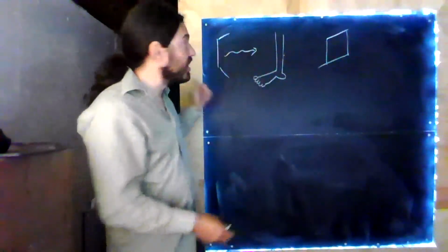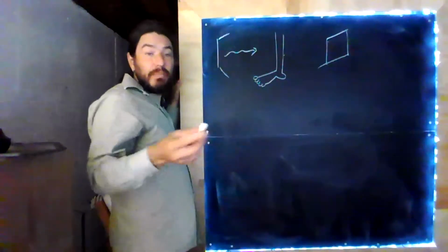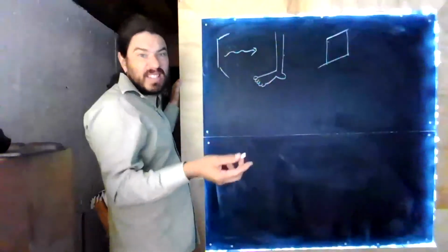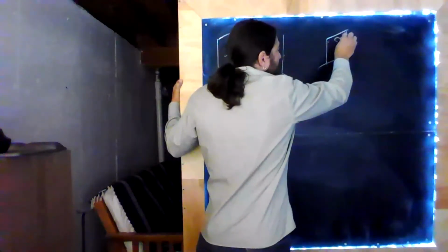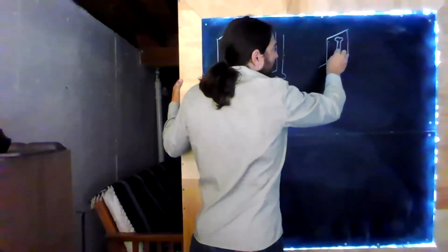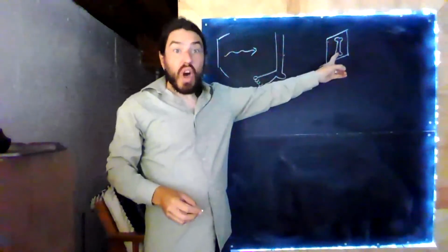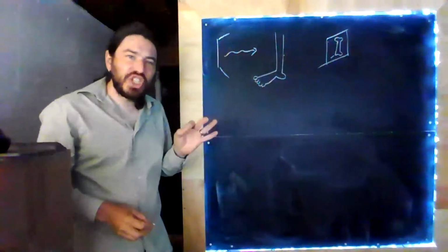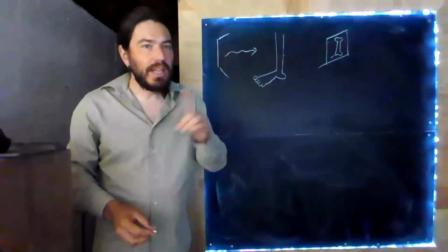If they hit some soft tissue, they go on through and expose the film. And if they hit a bone or something like that, then they get stopped. And so you're kind of seeing an image of the shadow of your bones. I won't draw all the leg bones on my picture, but at any rate, you just see the hard things. Why? Because it's kind of a shadow. So it's similar to regular photography, but a little bit different.